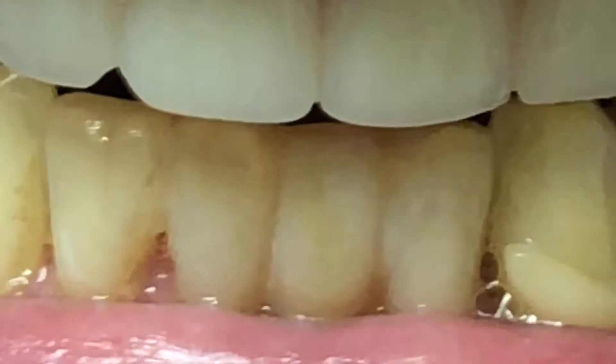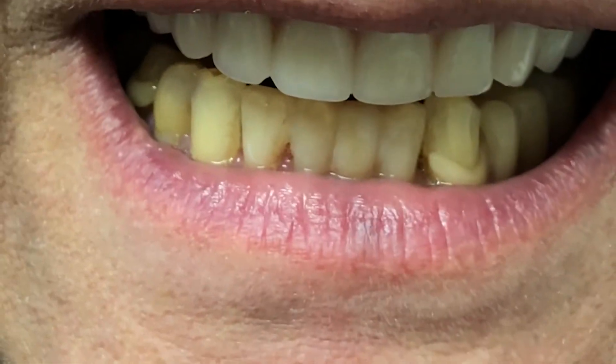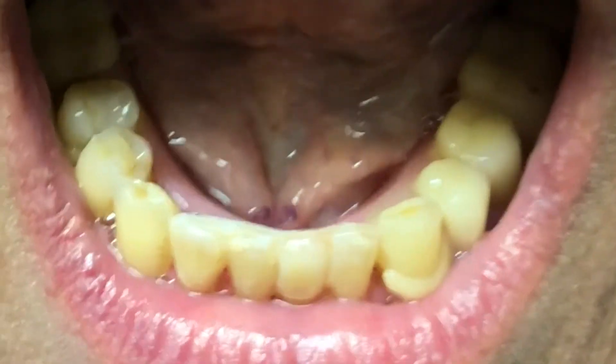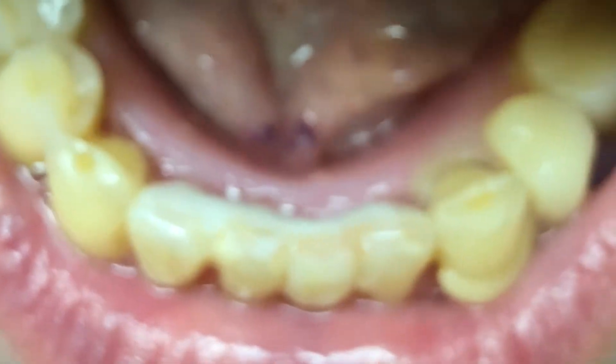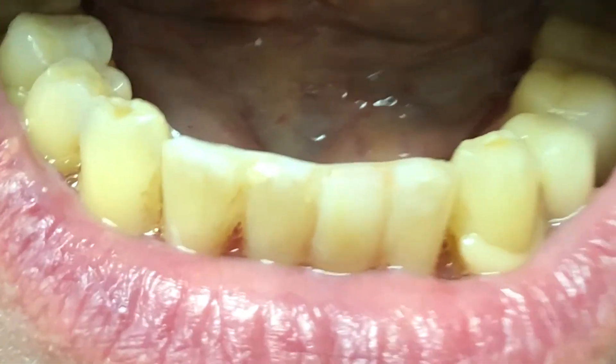Are you happy? Now are you going to eat nuts? Yes. So that tooth in the front is not connected to the denture anymore, but you have to clean it underneath. Open big. This is called a bonded Maryland bridge.